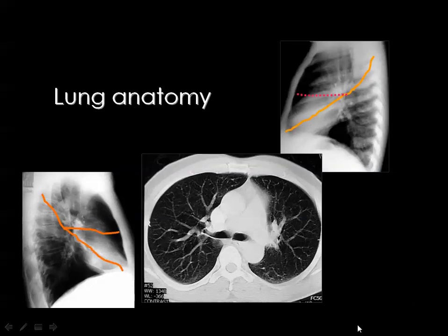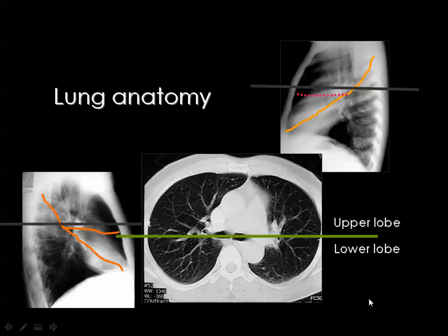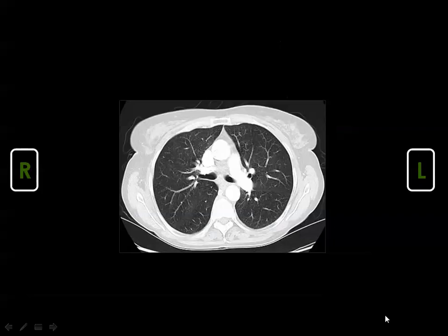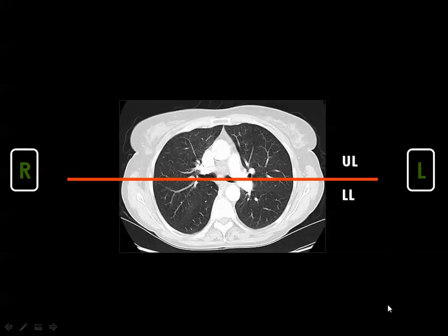When the trachea divides into two mainstem bronchi, you are near the hilum, and the section divides into two. On the left side you see part of the upper lobe anteriorly and part of the lower lobe posteriorly; the same on the right. At the CT section level of tracheal bifurcation, the anterior portion is the upper lobe and the posterior portion is the lower lobe.